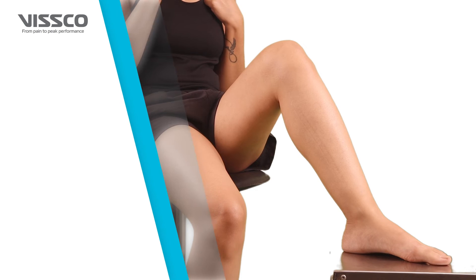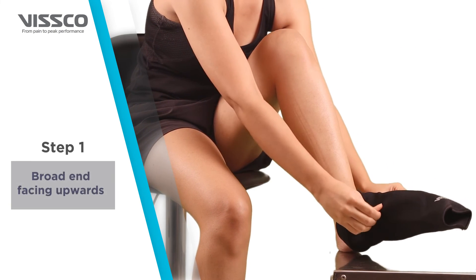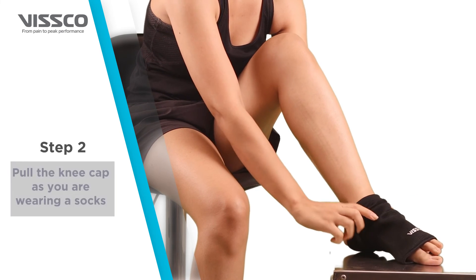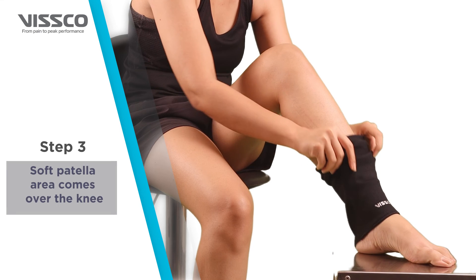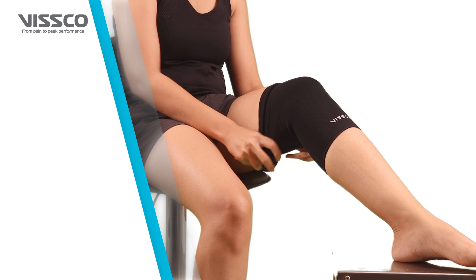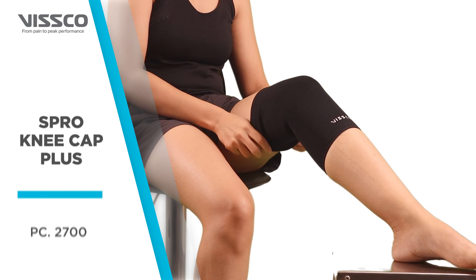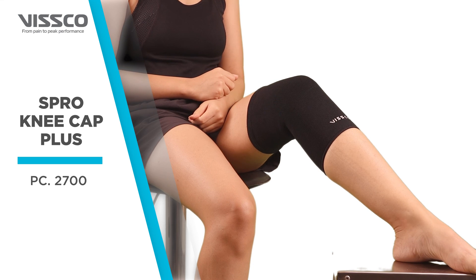Now that you have selected the right size, let's wear the product. With the broad end facing upwards, pull the kneecap on as you would wear a sock. Make sure the soft patella area comes over the knee. Your Viscose Pro Knee Cap is now ready to use.